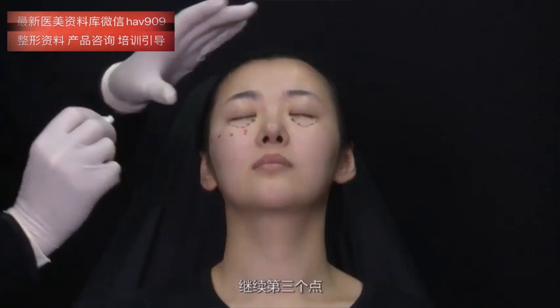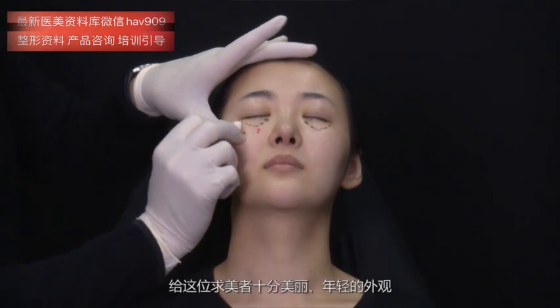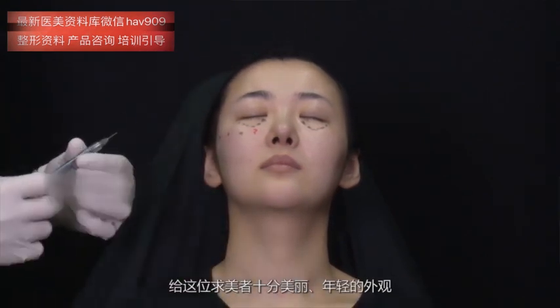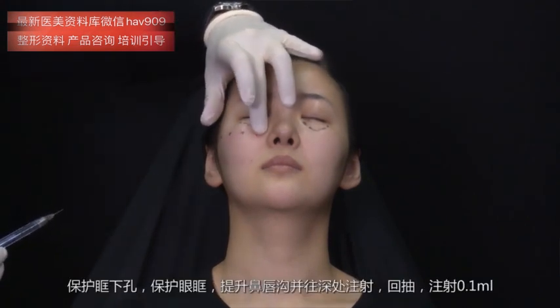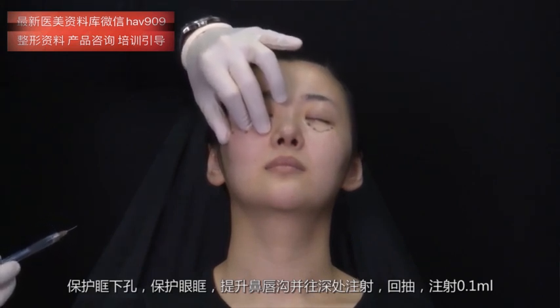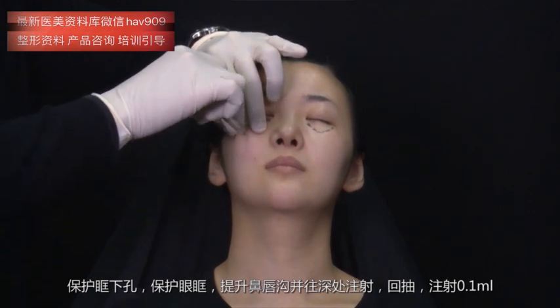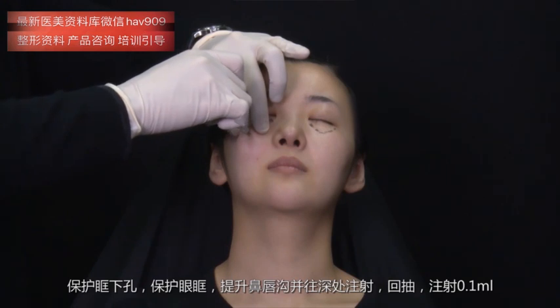Now let's proceed with point number 3 to give a very beautiful young look for this patient. Protect the foramen, protect the orbit, lift the nasolabial fold, and inject deep. Aspirate and inject 0.1.